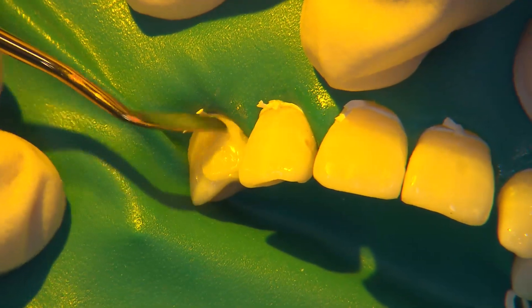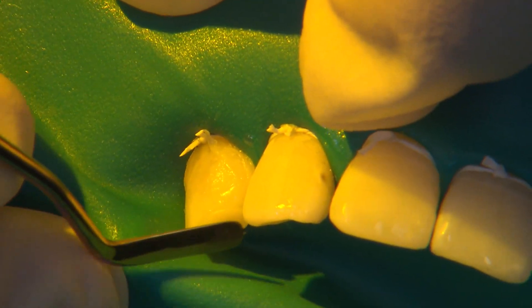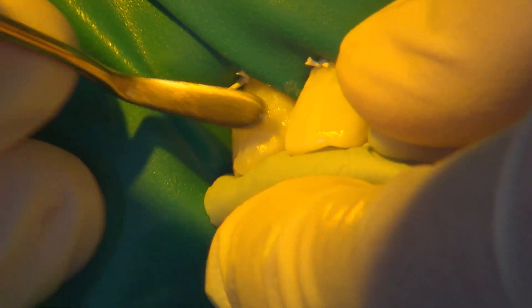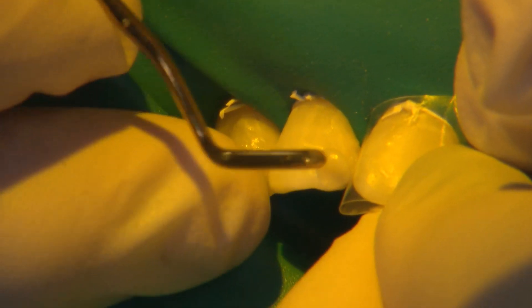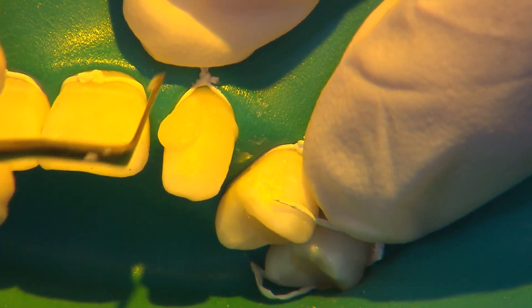I begin the resin application with a spatula-shaped instrument by applying the material as far cervically as possible to establish a new natural emergence profile. The putty matrix aids in determining the new incisal edge position, and the interproximal scalloping along the incisal embrasures indicates exactly where I should extend the resin application on the proximal surfaces. I use a spatula resin applicator for most of the resin placement and shaping; for finer shaping, an explorer or probe can be used. To fully polymerize the material, we light cure for 20 seconds. I am extending the mesial surface of the lateral out to reach the central. I like Camouflage because it is very easy to manipulate intraorally to the desired position and shape, and a nice benefit is it doesn't stick to my instruments. If composite materials do stick to your instruments during application, a light coat of bonding agent usually alleviates that issue.